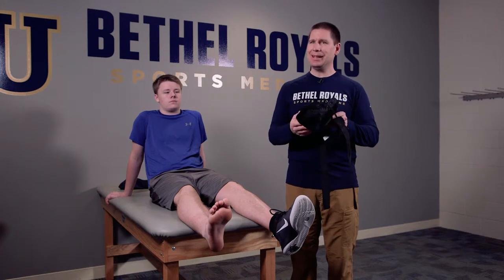This particular one is what's called a lace-up, which means it has laces that you would tie up. Not every brace has that, but this happens to be a fairly simple, easy one to use. It ranges anywhere from around $15 to $25, so it's a very economical option.